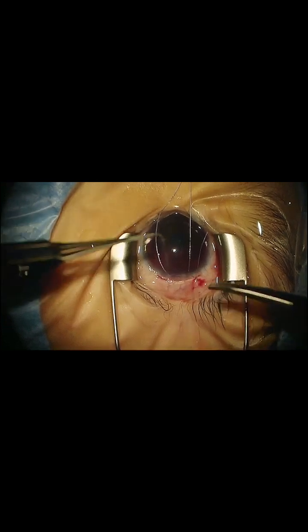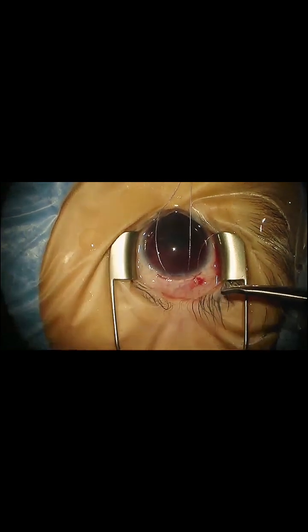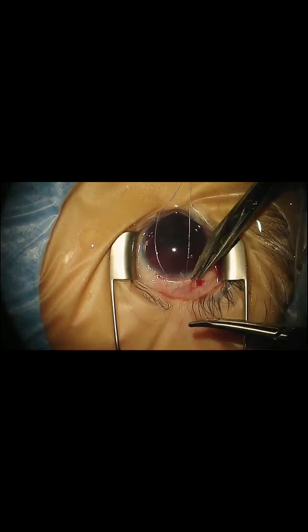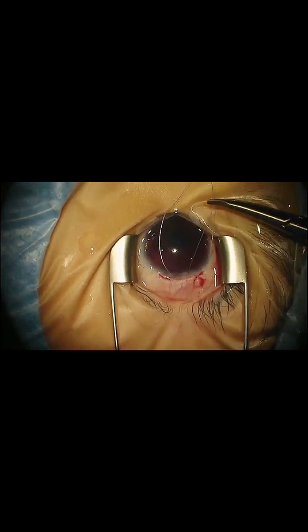Something I think that's interesting about this patient is the relative lack of Haab's striae and corneal scarring. Did you measure the intraocular pressure? Oh, yes, good question. We did at the start. It was 31 on the right eye and 35 on this eye.